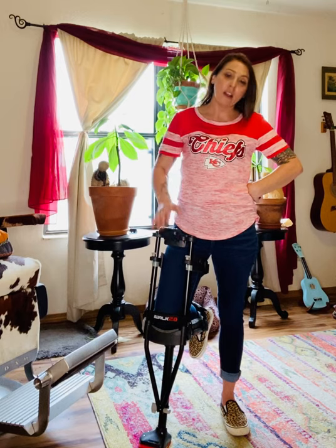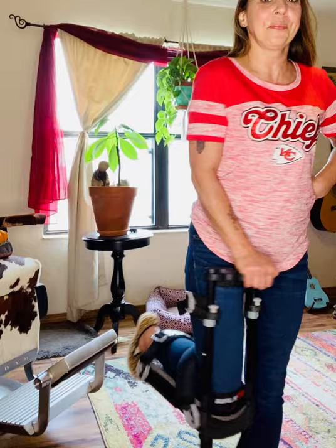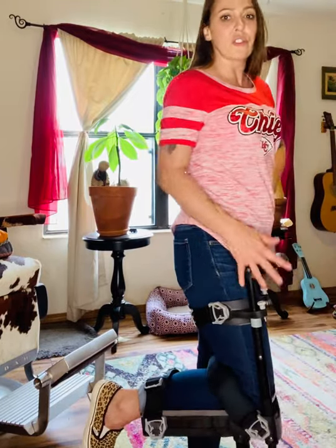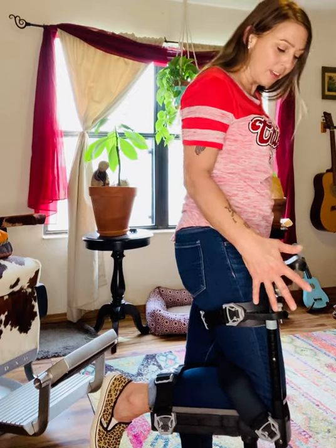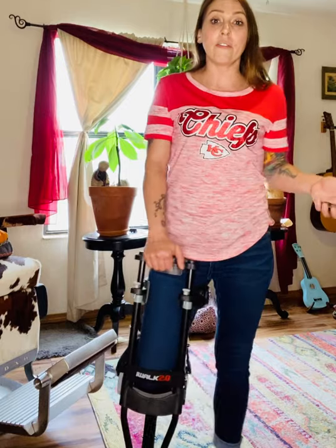It's very easy to put together. I've got my handle here — as you can see I've got my thigh and my calves strapped in so I'm nice and safe. I can configure the foot arrangement so it can be for right foot or left foot.